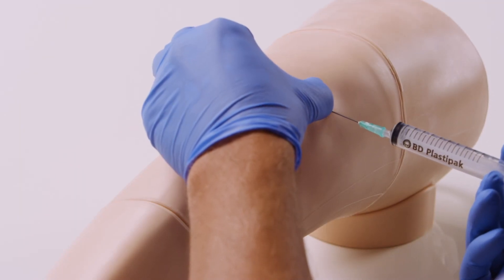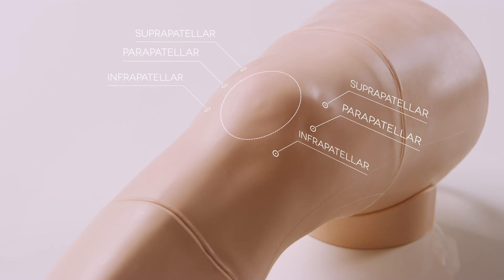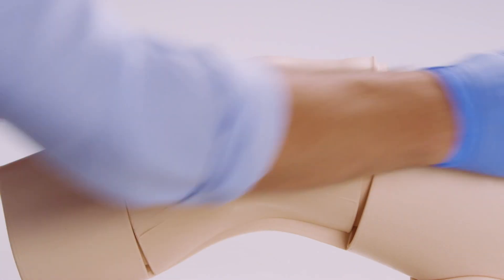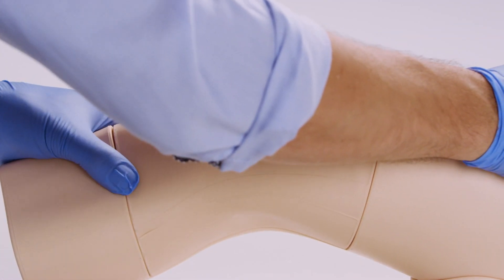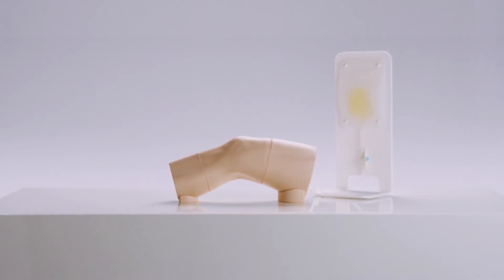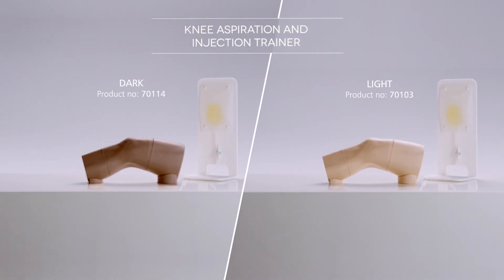Aspiration and joint injections can be practiced across the six most commonly used sites on the knee. The cost-effective model can withstand 1,000 stabs before replacement. The trainer offers a complete training tool for aspiration and joint injection, allowing the practice of fundamental skills in a safe environment.